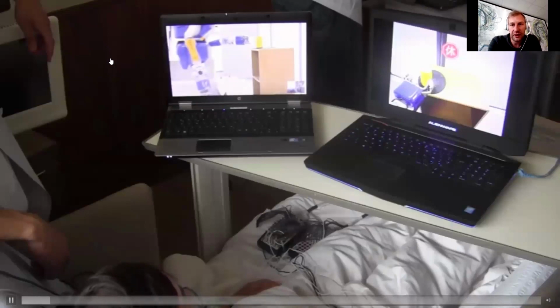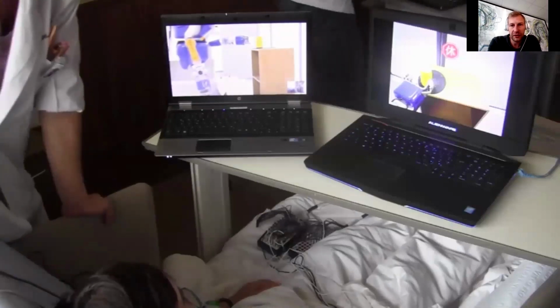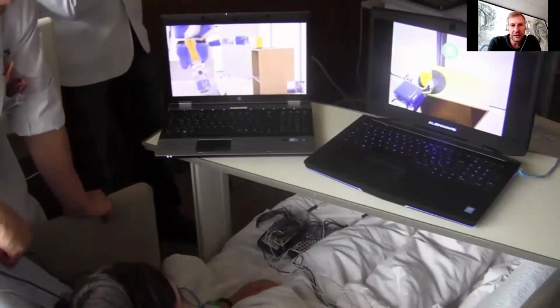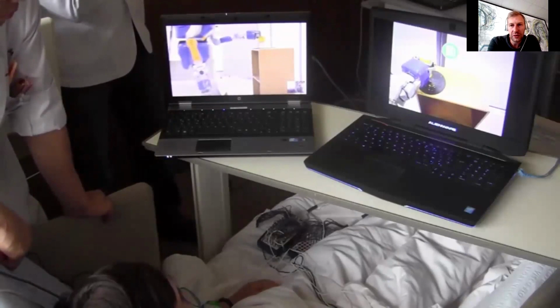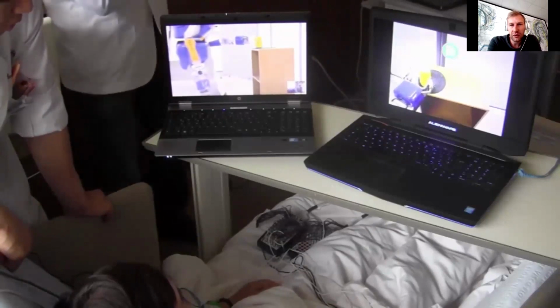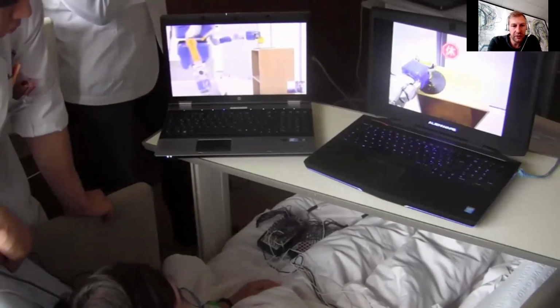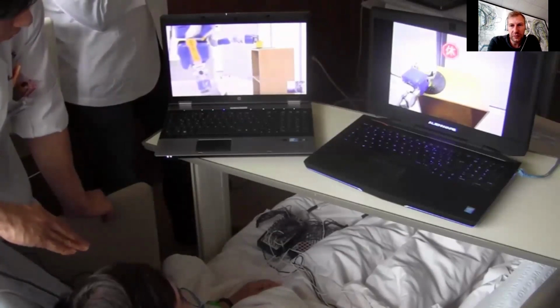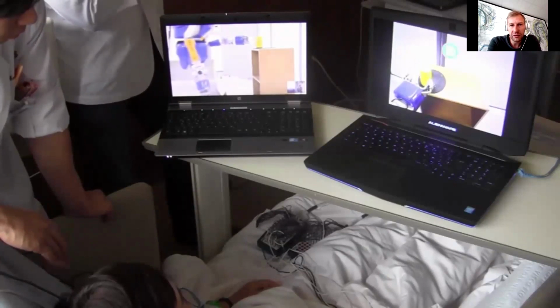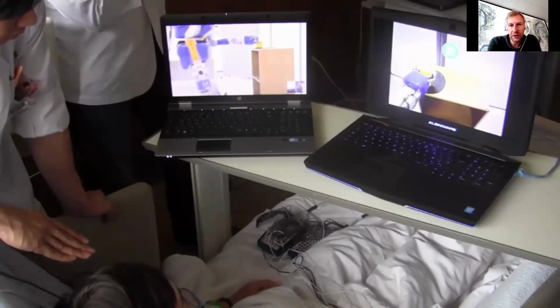Another example is when we want to interact, for example, through robotic devices. So here we can see an experiment that we set up within a joint collaboration with France and Japan, where in a Japanese patient, a humanoid robot was controlled by using only motor imagery band power features from ECoG grids.